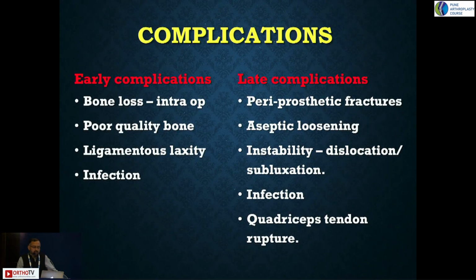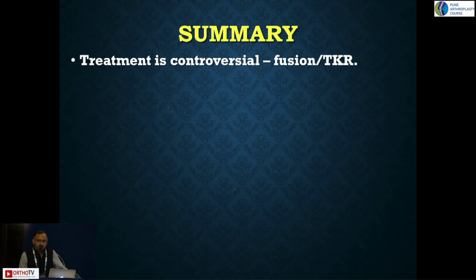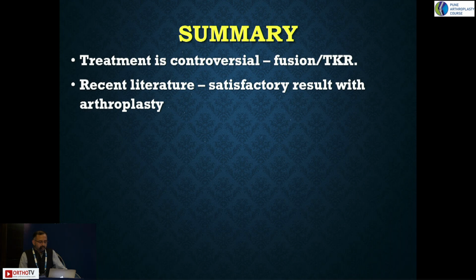It also has its own share of complications. This is a big topic of discussion; I'm not going to go into details. Aseptic loosening, infection and repeated episodes of periarticular instability are definitely reported. Treatment is controversial between fusion and TKR, but yes, you have to judge, have a dialogue, do a thorough clinical assessment, radiological assessment, and then plan your TKR.